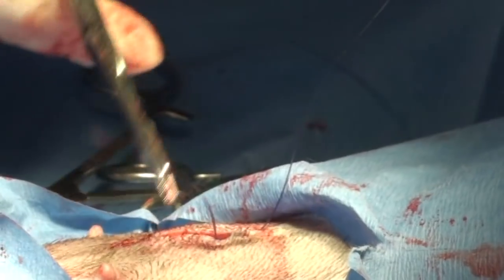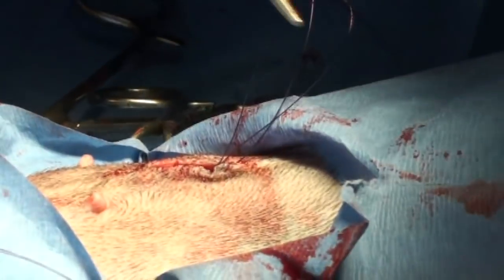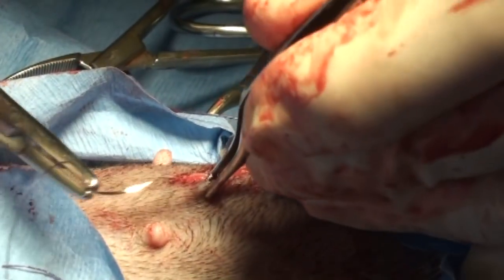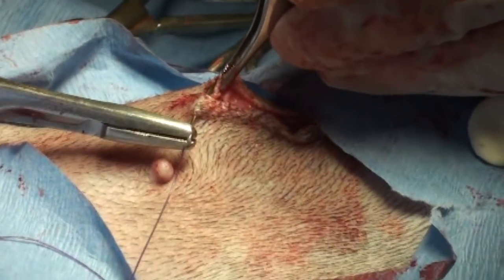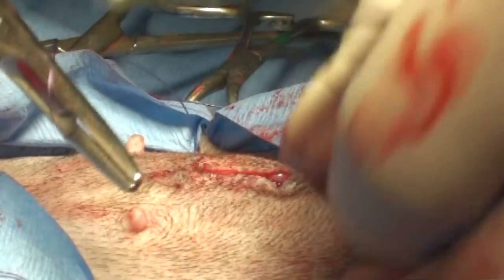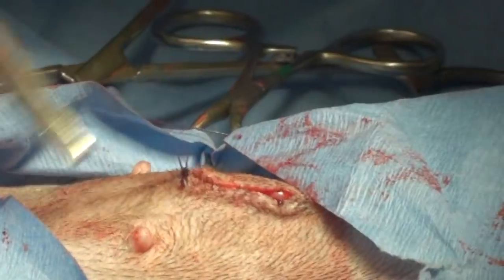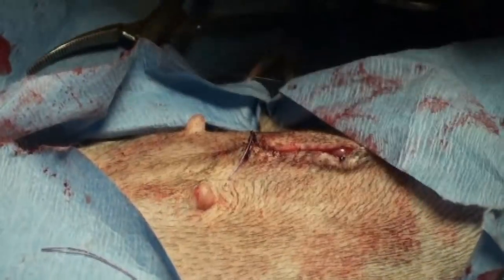I had to save that because I didn't want to let it disappear — that's the knot I have to tie. Now we're going to put some skin sutures in. I put the skin suture straight through, straight through the other side just like when you're sewing. That's the difference between sub-Q and skin sutures. Usually these skin sutures have to come out because they will dissolve slowly but will stay there, so we'll usually just take them out about two weeks after it's healed nicely.